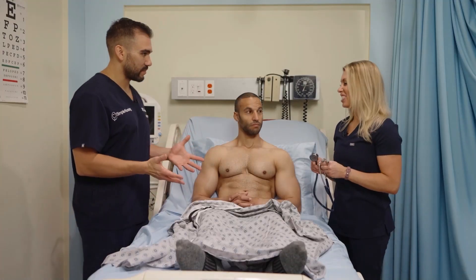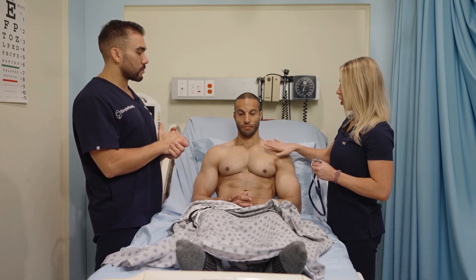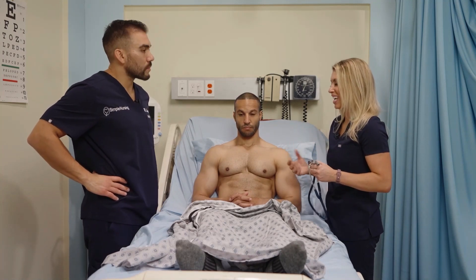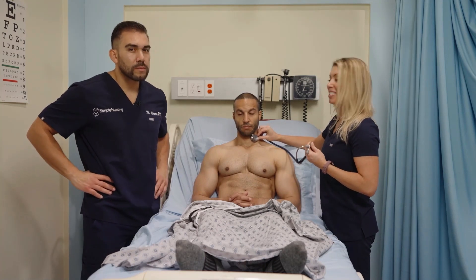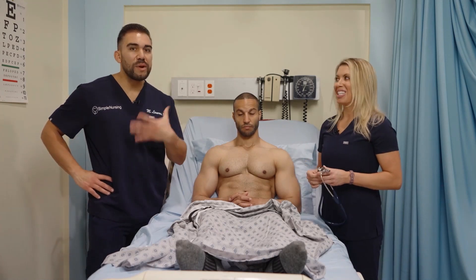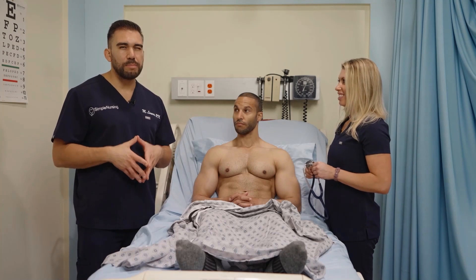Now let's talk about bronchial, bronchovesicular, and vesicular sounds. For bronchial sounds — we talked about vesicular over the lung fields being softer, kind of musical. But if you're listening over the client's trachea, it's going to sound very loud, like air going through a big tube, because your trachea is a big tube — the windpipe. We call those bronchial sounds, and they are loud and booming.